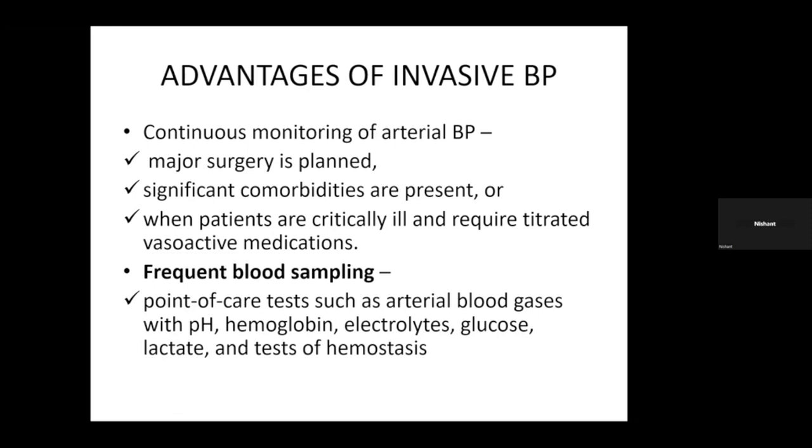Sir, so what makes invasive blood pressure preferable over our conventional non-invasive blood pressure? So this is for continuous beat-to-beat monitoring of arterial blood pressure. Where is it indicated? So whenever major surgery is planned, like cardiothoracic, neurosurgical, or in which surgeries where major hemodynamic shifts are predicted. And coming to the patient factors, when there are significant comorbidities or when non-invasive blood pressure is not reliable, such as in morbidly obese, hypovolemic, septic shock patients, patients in cardiac failure, or burns where NIBP we can't rely on, or where the patients are critically ill.